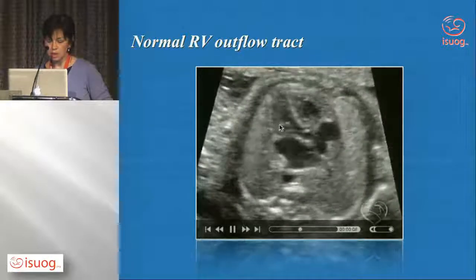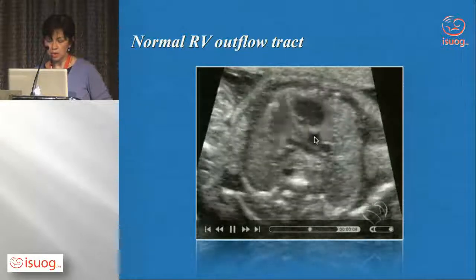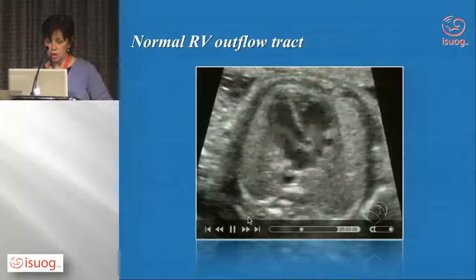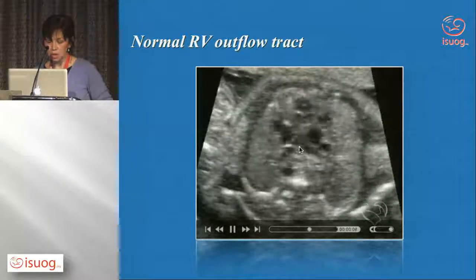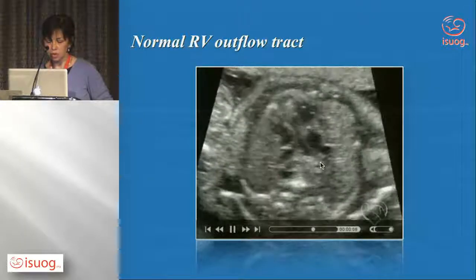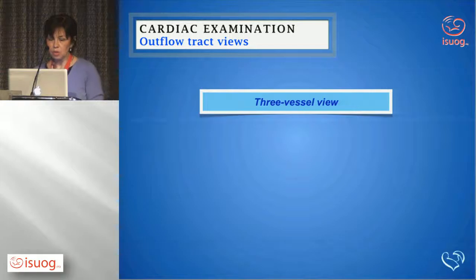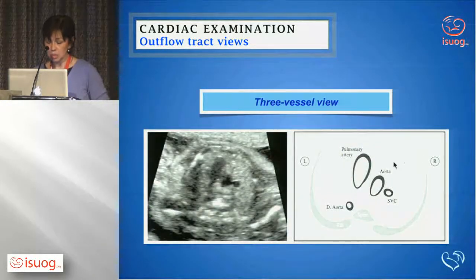We have here the left ventricle, the proximal aorta, and that's the aorta, already starting to come into your 3-vessel view. And we see here the bifurcation of the pulmonary artery. So even without wanting, we're already on the 3-vessel view, and that's basically demonstration of the pulmonary artery, aorta, and the superior vena cava, and I'll show you more details of that in a few clips more towards the end. But pulmonary artery, aorta, and SVC.